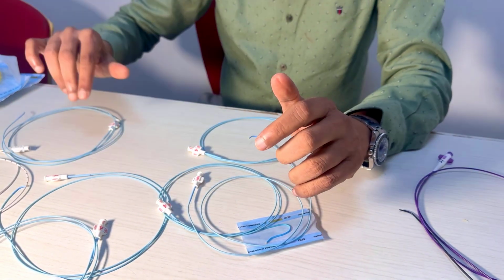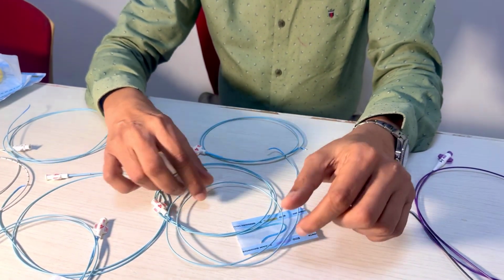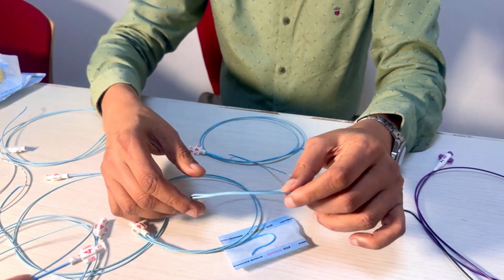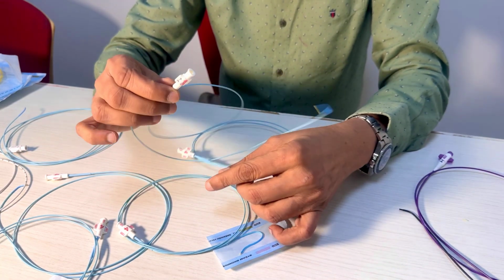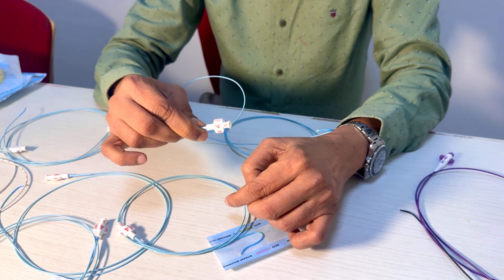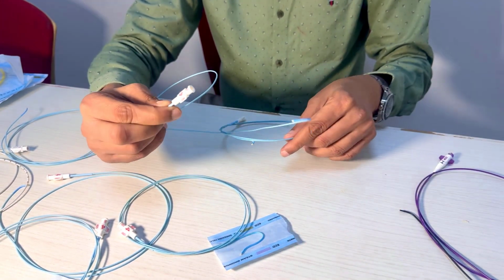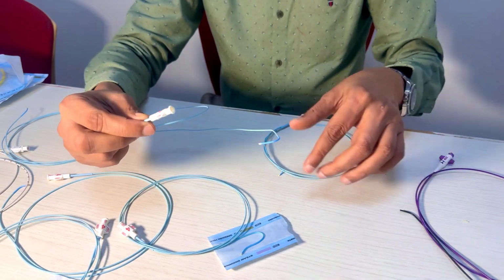Or if I take another catheter, a visceral catheter like this one, you'll see it has a length of 80 centimeters written. Now, why is this important? Suppose you are going to take a patient and you want to use a long sheath.